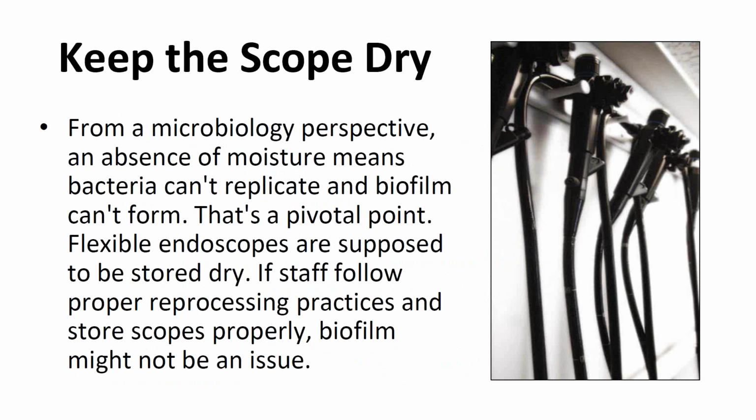These endoscopes have to be completely dry prior to going into storage, and if not, they can be recontaminated by the environment or the water that was used in the endoscope after disinfection, in order that the scope is not recontaminated by the environment or that water. Next slide, please.